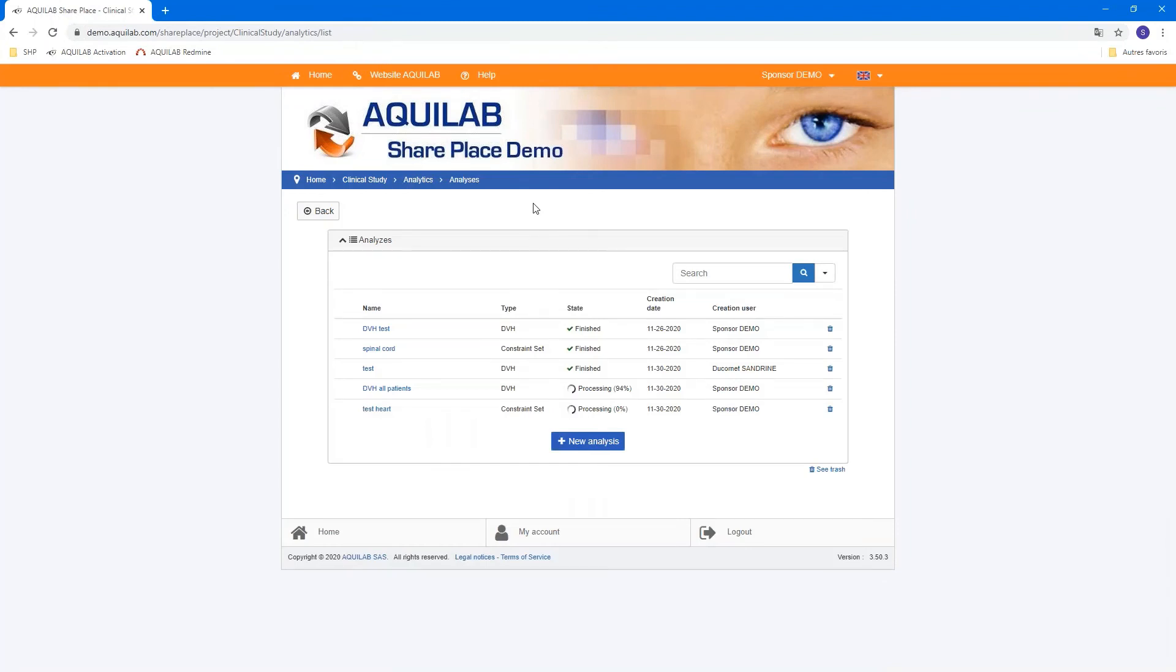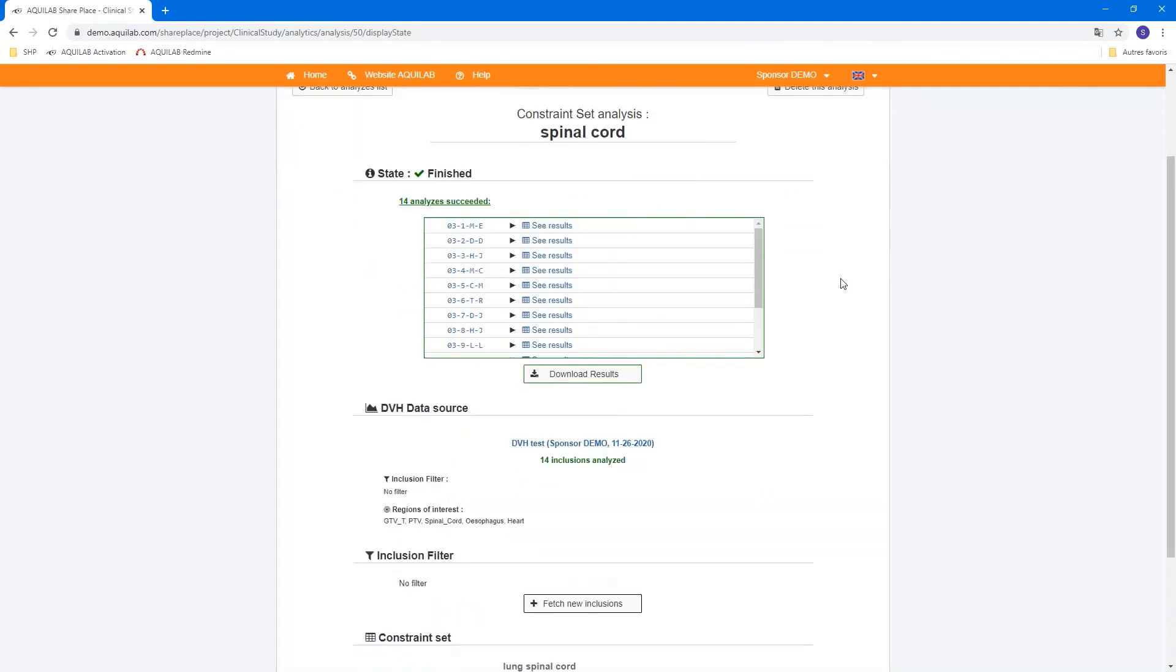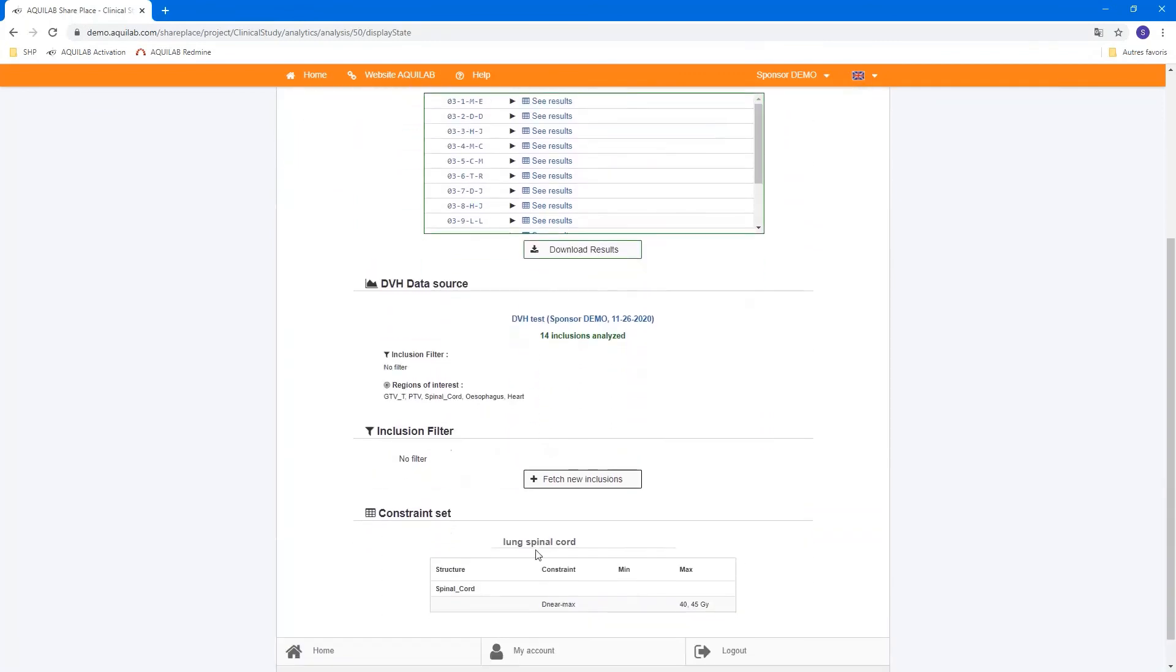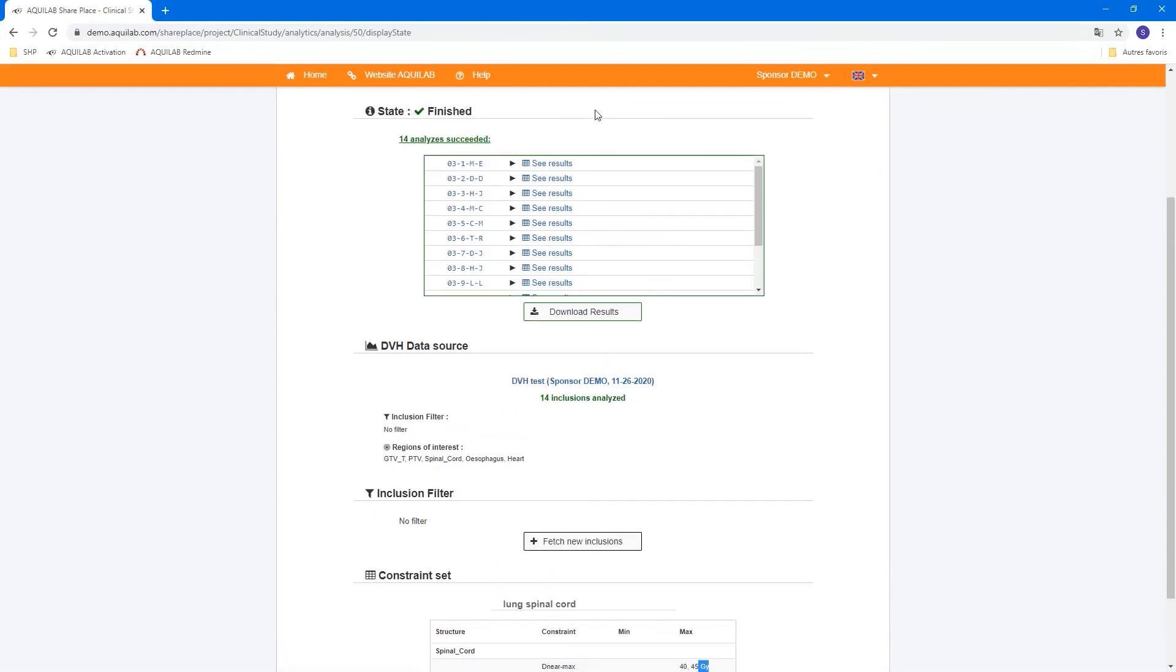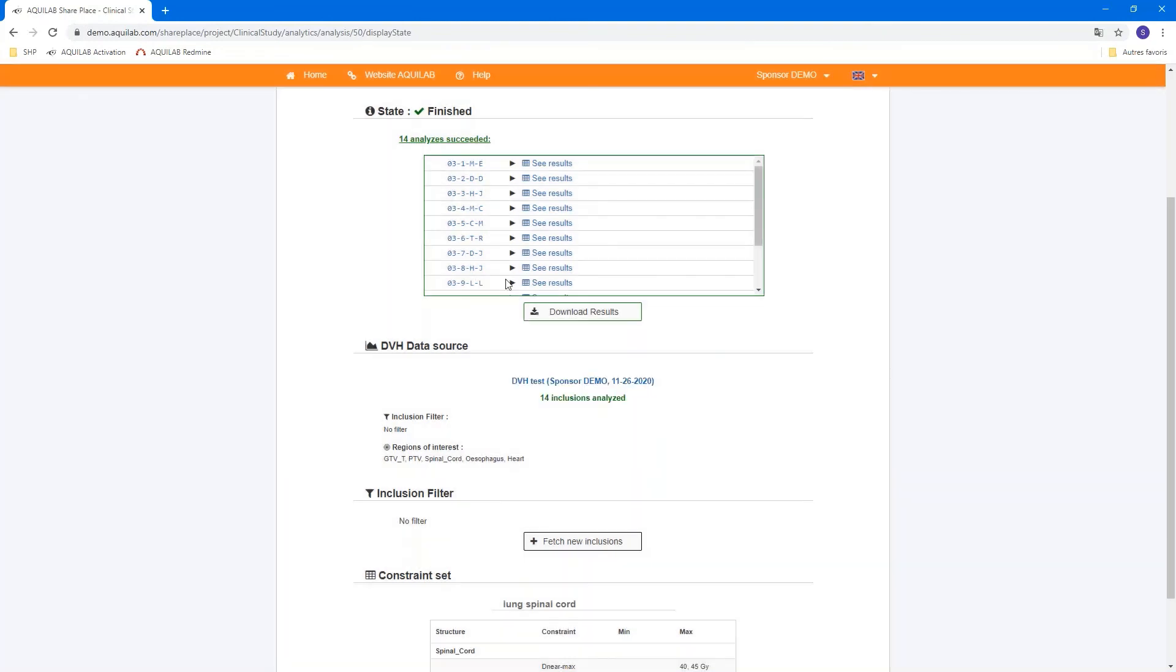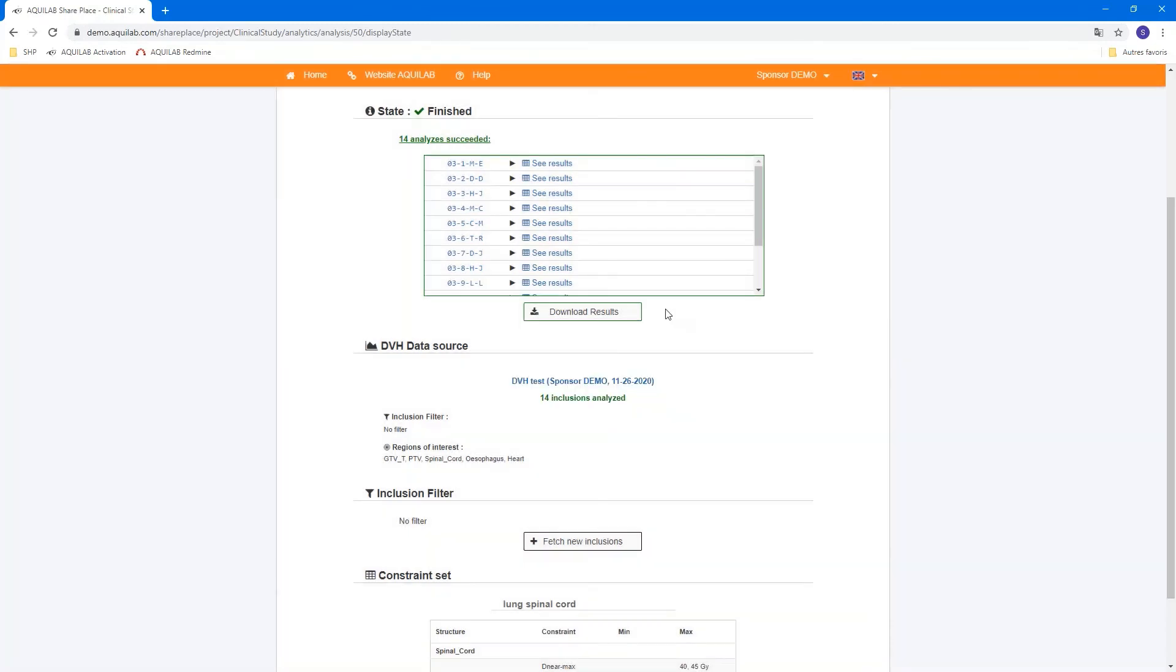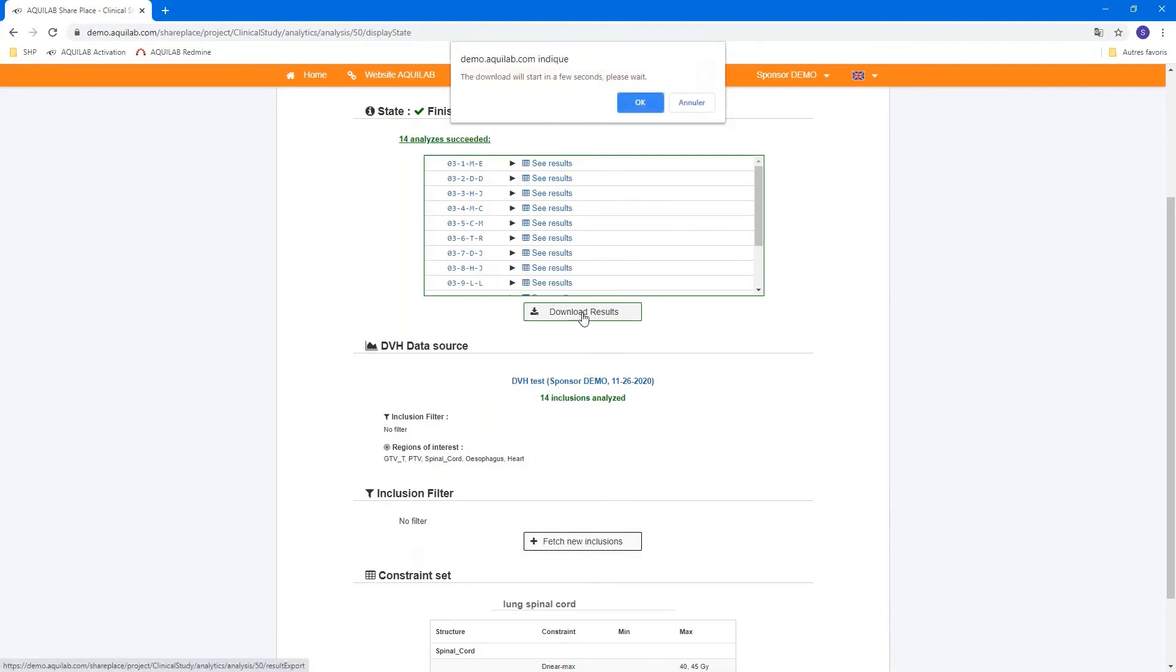I'll show you now how an analysis looks like after calculation. For this example, I select the spinal cord and I apply a constraint set for the Dmax to calculate and the maximum of forty and forty-five grays. And we can see results. All results appear now like this with the volume and the Dmax in gray. You can see it's highlighted in orange because it's between the relative and absolute deviation. This one is green because it's below the limit.